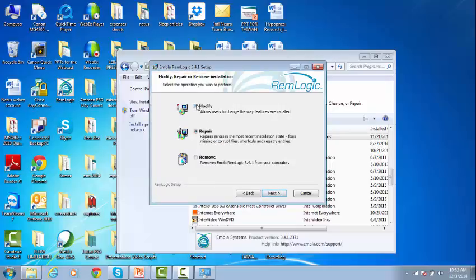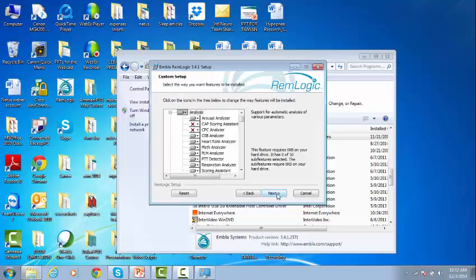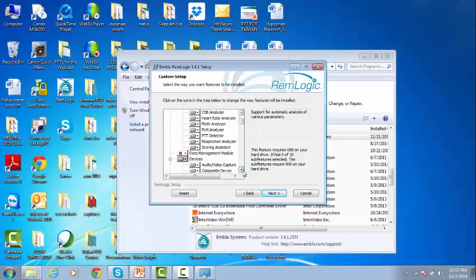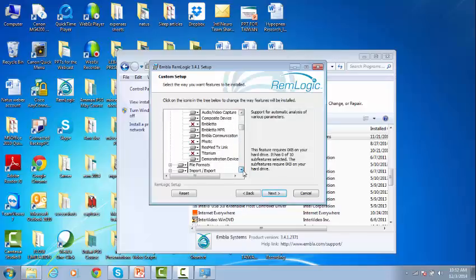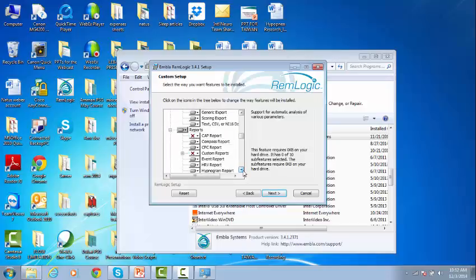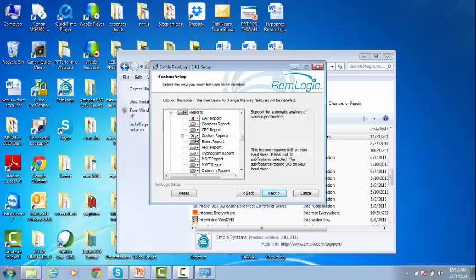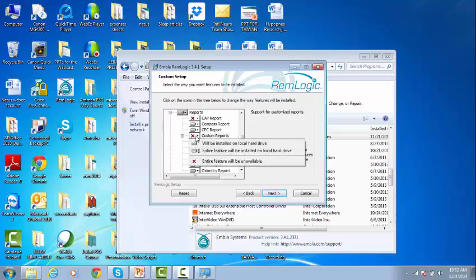Select To Modify, click Next, and the Custom Setup window will pop up. Drop down to the Reports section, and left-click on Custom Reports.